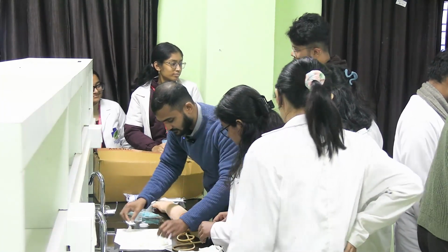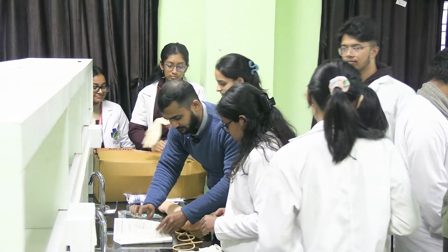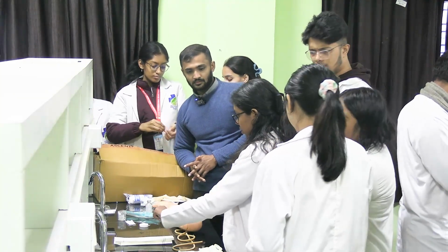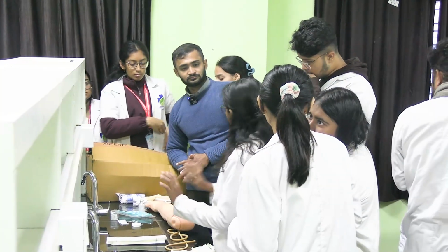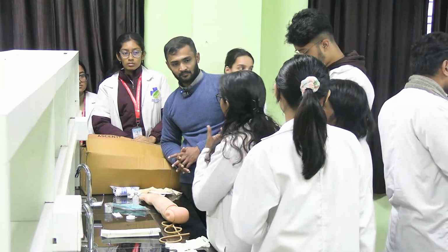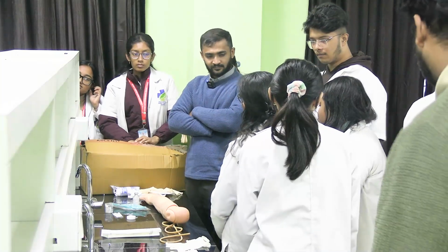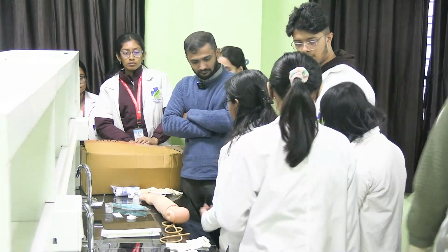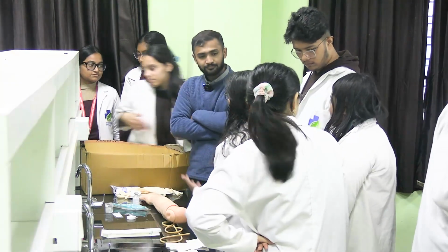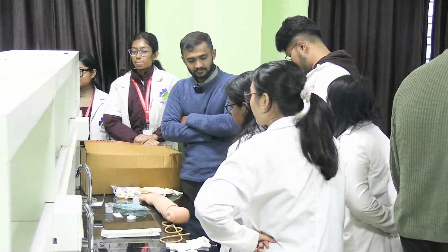Okay, first start from the first point. What is the first point? Introducing yourself. I am Shubhashmita Chakraborty, a second year student of Tripura Santiniketan Medical College. Then I'll explain the procedure to you, and after the patient gives me permission, if yes, then I'll proceed. Okay, so what is the first thing you will do after consent?